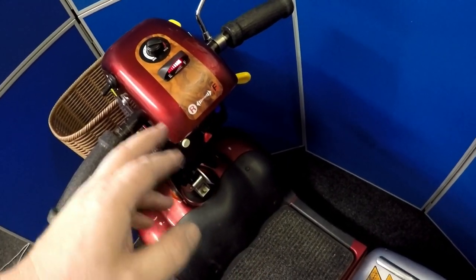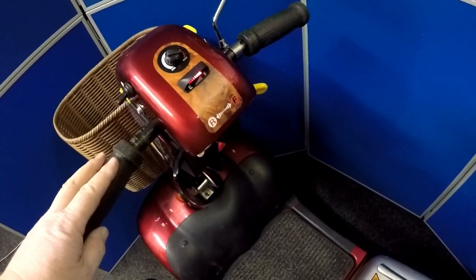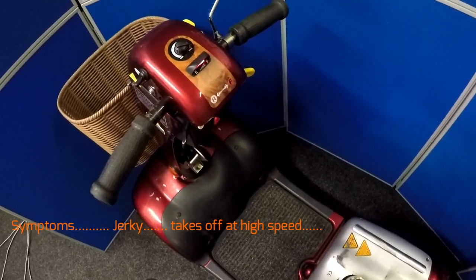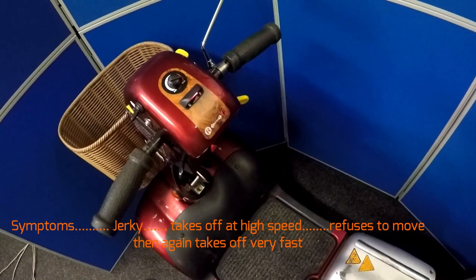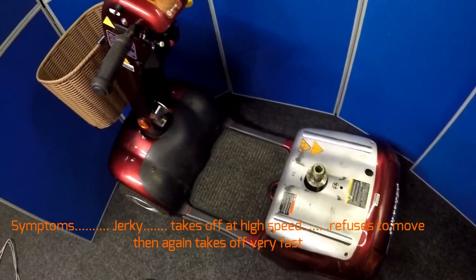The audible beep — one minute the motor is working, now it's not. The audible beeping tone tells us there's an electrical problem somewhere. I personally think there's a problem inside the motor, due to the customer stating the symptoms: one minute it will go, then it won't. You press the lever, it won't move, it will go slow, it won't move and then it will take off like a rocket. Now the motor was working and now all of a sudden it won't.